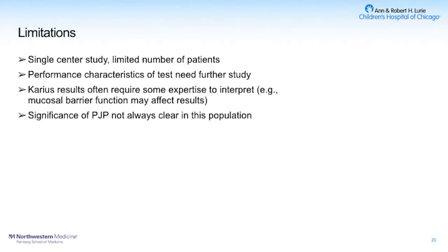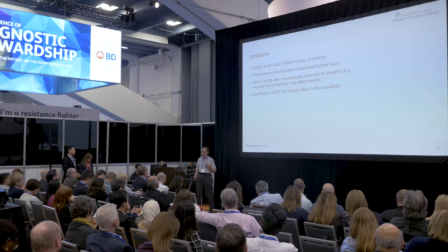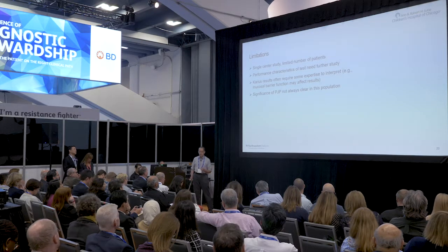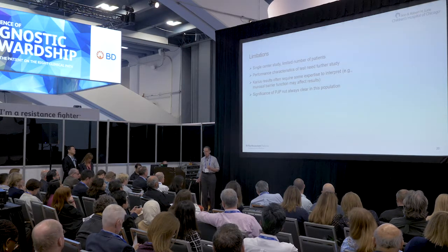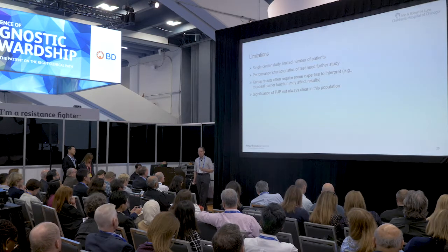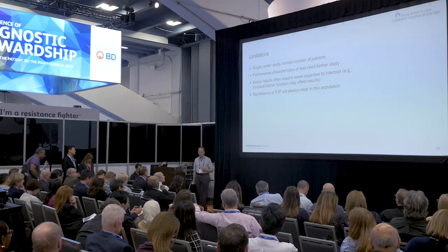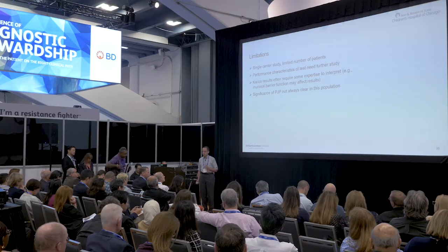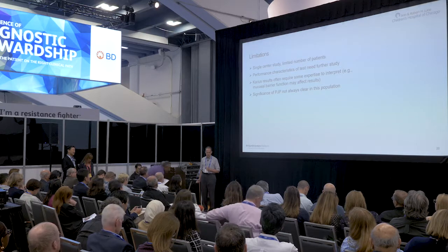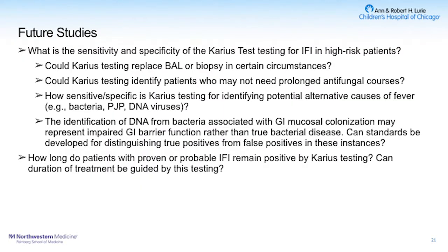We also highlight these polymicrobial tests, and I think this calls to mind that we do require some expertise to interpret this, and this keeps infectious diseases physicians important in terms of interpreting these results. And I mentioned 2 patients that had positive pneumocystis testing, which was unclear if that was the source of disease in those patients. And so I think we need a little bit more data to prove whether or not that is an important finding with this test.